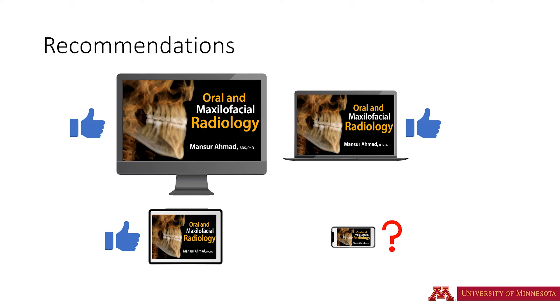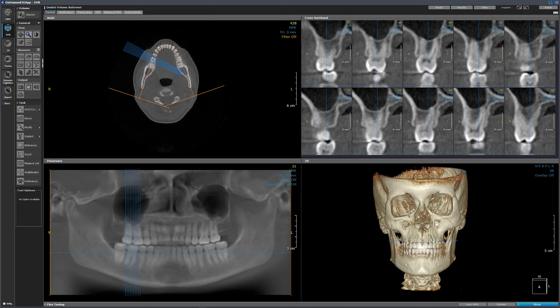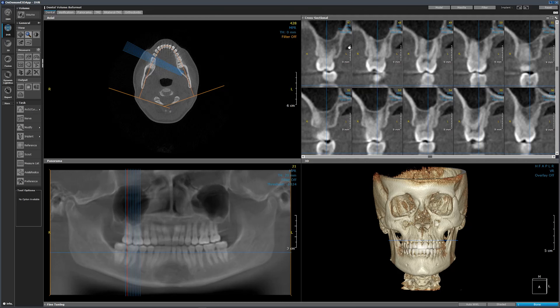Before we learn the anatomic landmarks, let us understand how to view a CBCT scan. I am using a software called OnDemand3D. Other CBCT software will have similar but not identical interfaces. There are three ways of looking at a CBCT scan. First, we can look at the CBCT data as slices. These images represent slices or sections, and each image represents a part of the anatomy — in this case, one or a few teeth.